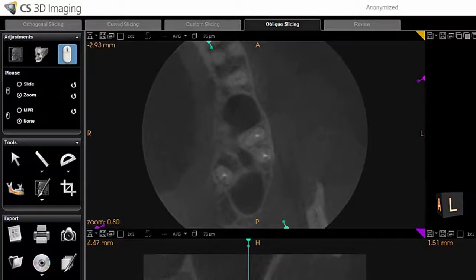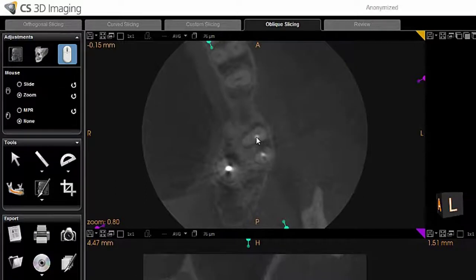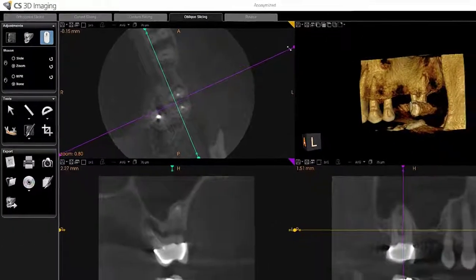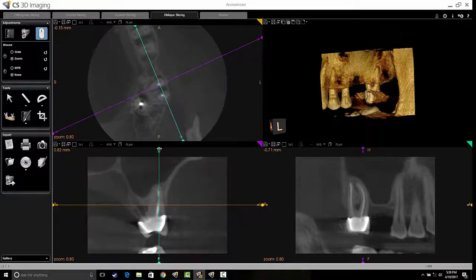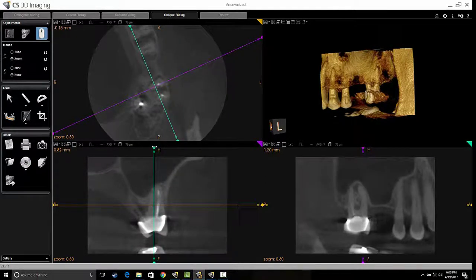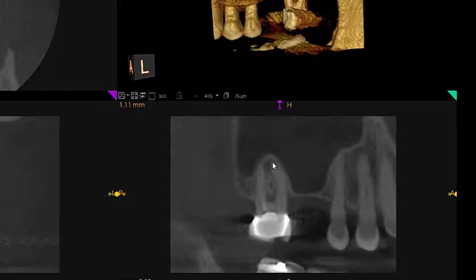Staying on the mesial buccal root, my goal was to see if there was an MB2 canal. Looking at the top left-hand corner, the MB1 is eccentrically positioned, and there is a suggestion of an MB2 as well. Adjusting the view to play buccal to lingual, you see the MB1, and as I move palatally, we are picking up an MB2, which is probably the cause of the persistent radiolucency and apical periodontitis.